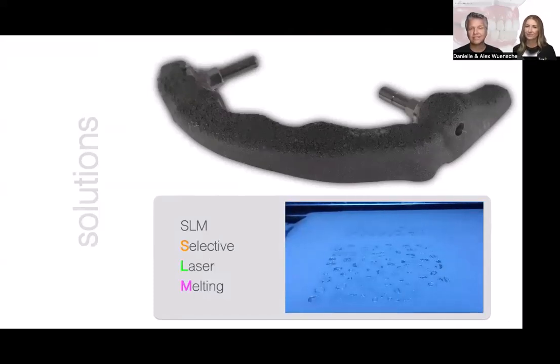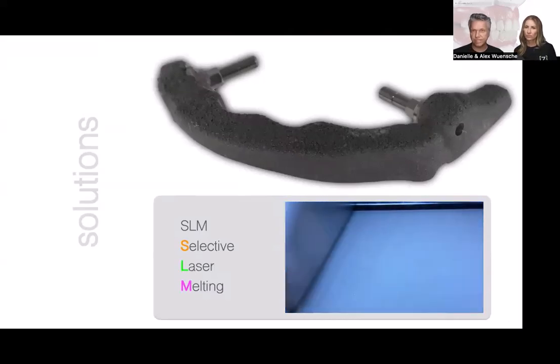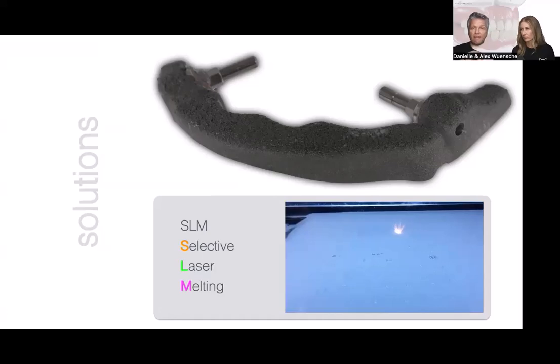I really like it. You see here that SLM, selective laser melting kind of procedure. You see there's that slide that applies the metal powder, cobalt powder, and then the sparks flying. Basically, that's the laser which melts these powders in place, and that goes layer by layer by layer, right? It will take a few hours to really build that frame or crown and bridge work. But you see here now we're seeing these structures coming out of the powder, right?